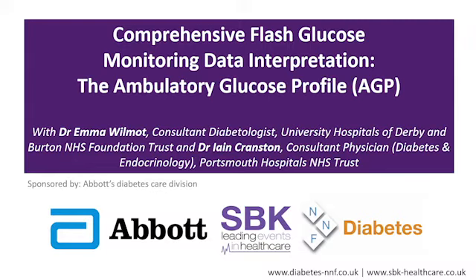So for me, the key about getting through this data is to look from the general to the specific rather than the other way around. There are some people that you never really need to get very far beyond the general, because they've got very clear statements that you can make from that. Once you've moved, hopefully in the right direction, and things start to get a little bit more specific around meal timings or whatever, then it becomes easier because you've already done that work.